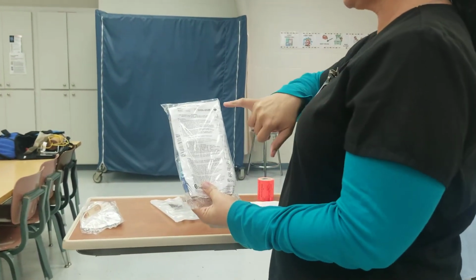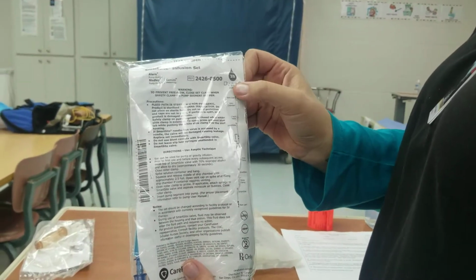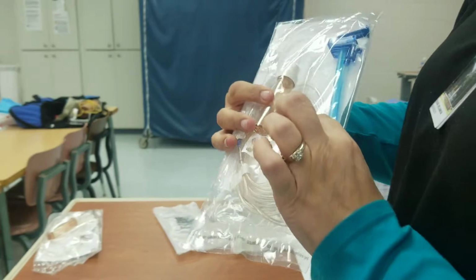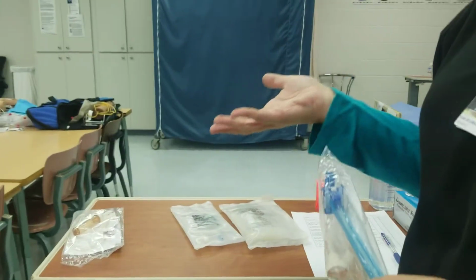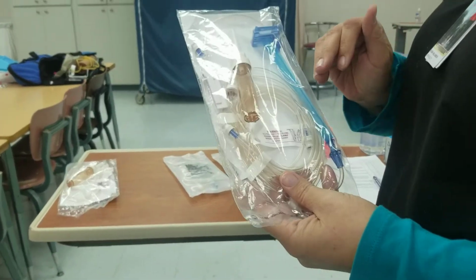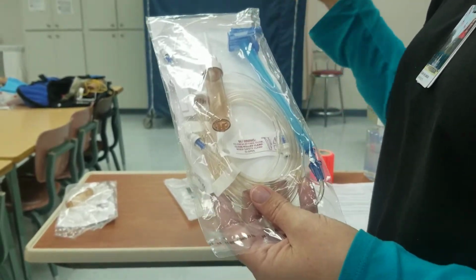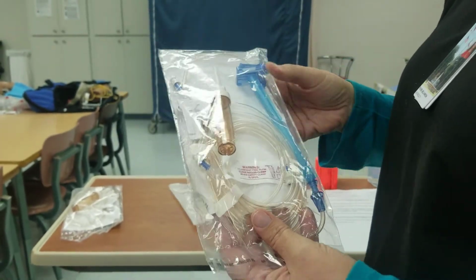So what we're going to start out with is your primary tubing right here. If you'll notice, it's got your drops per mLs on there, and this is 20 drops per mL. This is your primary tubing, and this tubing actually goes with our Alaris pump. Depending on where you're working, what kind of pumps, they'll have the tubing that goes with it. Then you'll also have tubing that you have to count the drops per minute. Make sure it's dropping, and it's fed in by gravity, and it's not connected to a pump.